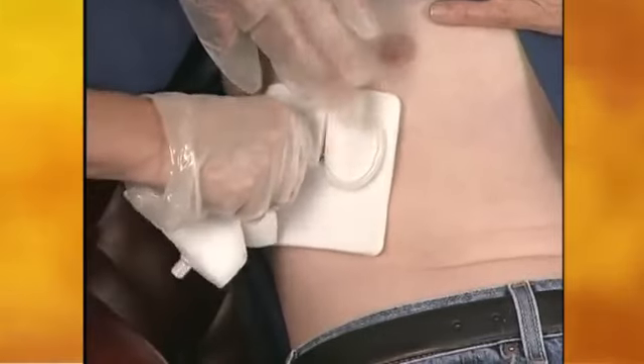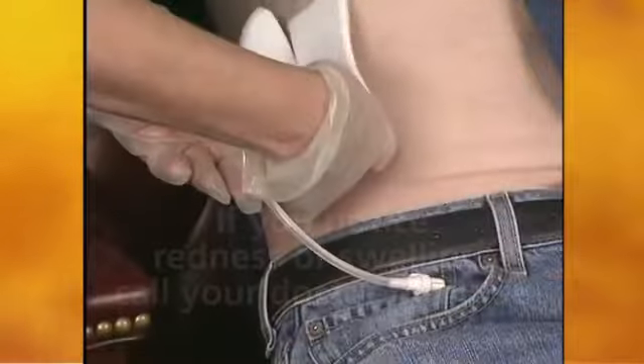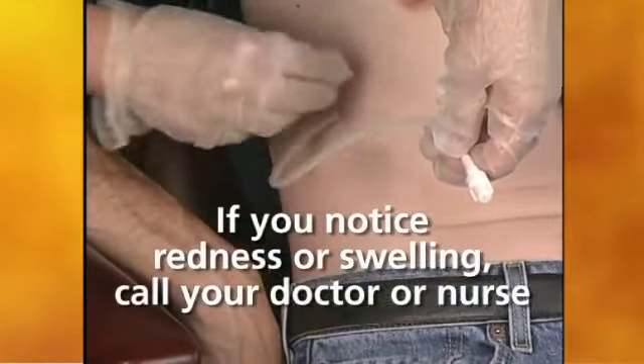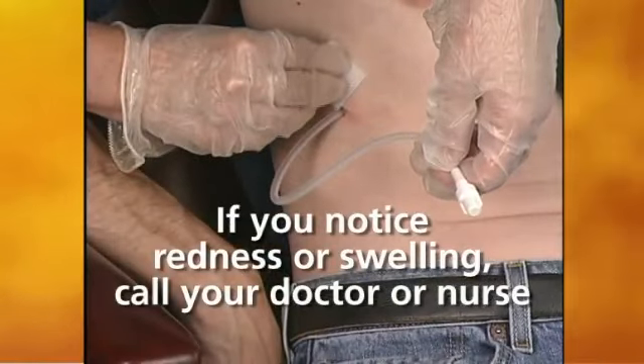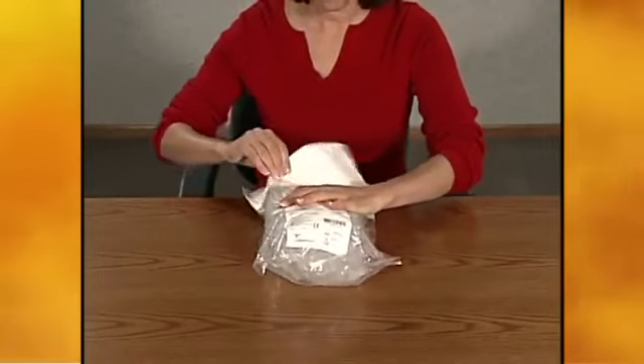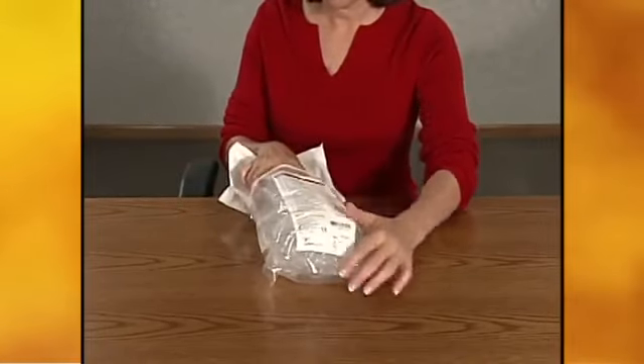Inspect the area for redness and swelling at the catheter insertion site. If there is any redness or swelling around the catheter, finish this drainage and have the patient contact their doctor or nurse. Open the drainage kit bag and remove all of the items from inside.